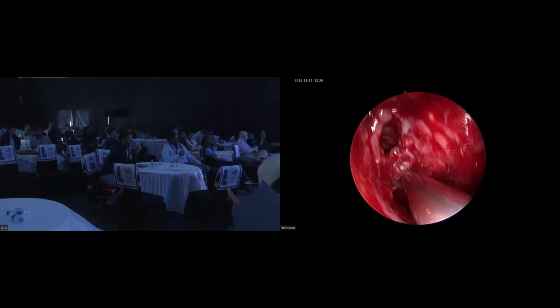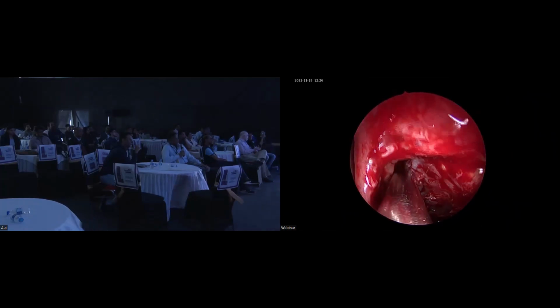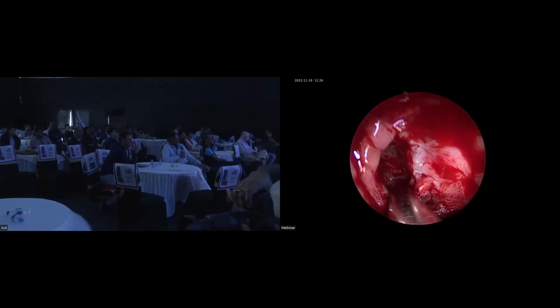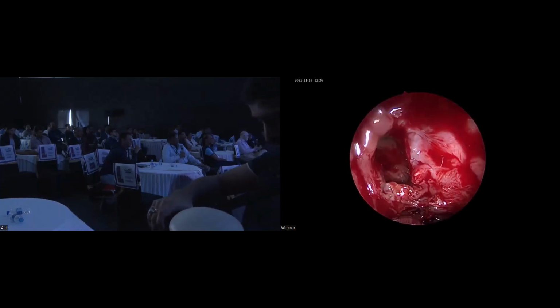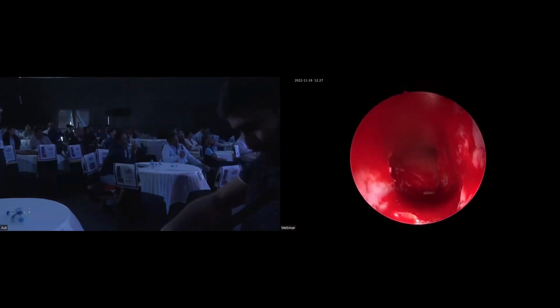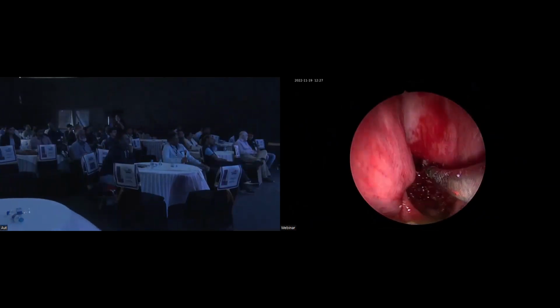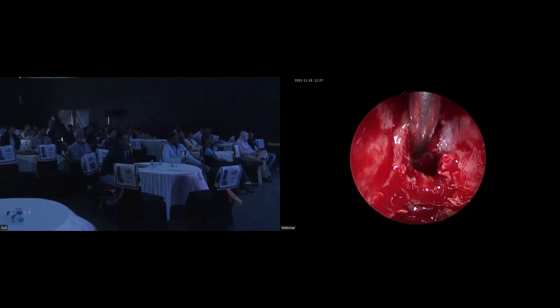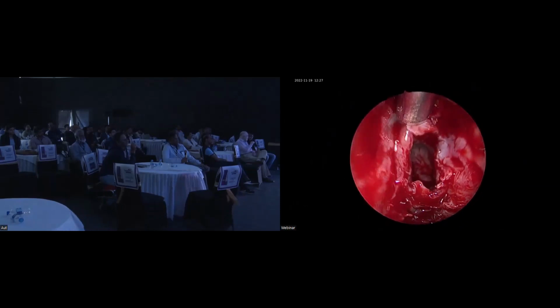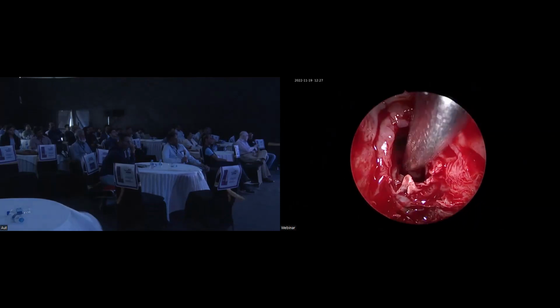This frontal is also communicating at some level to the opposite side of the frontal. And that is how, though there is not much disease seen in the nasal cavity, the opposite frontal is already involved. Yes. So you can see the illuminated frontal sinus. Here, those who are in the OT can see, but we still can remove this part of the disease. Okay.